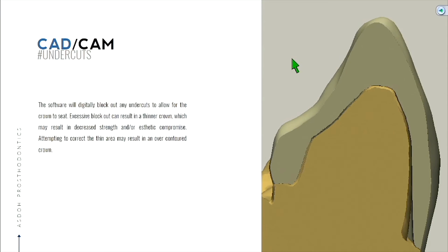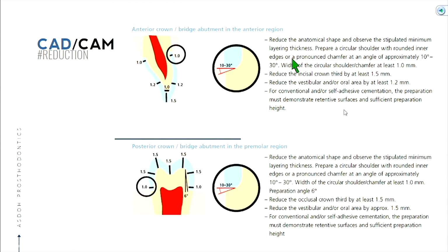Oh, so notice the top here. Remember we talked about recontouring your prep so that it's better adapted. So look how here, the burr is able to sneak into this area because they've avoided a sharp point in their preparation. So this is similar to what you want to see when you prep.